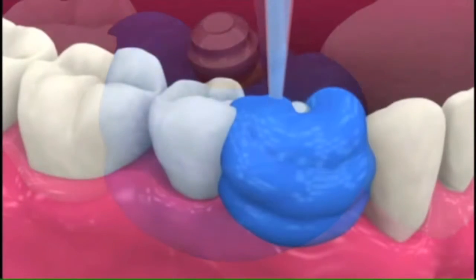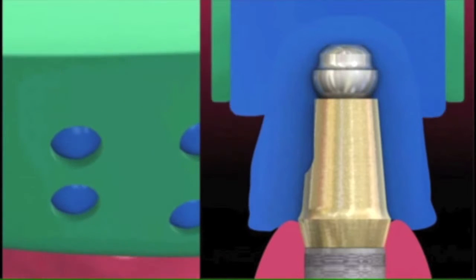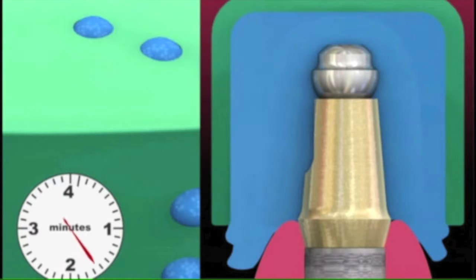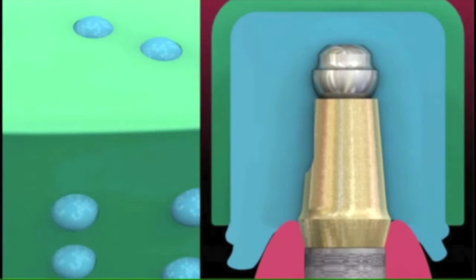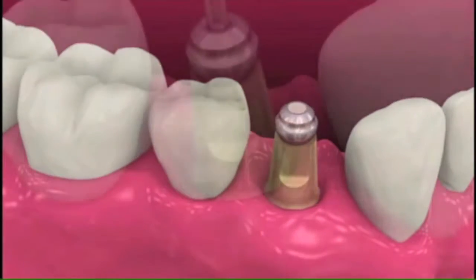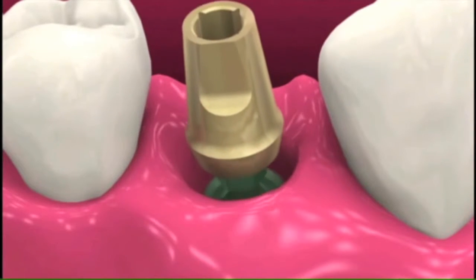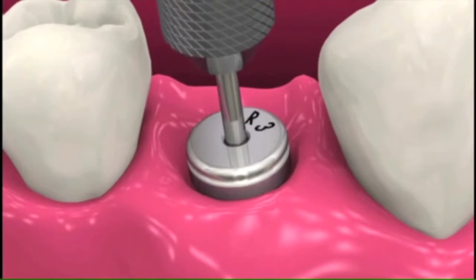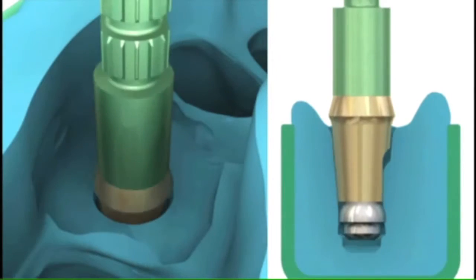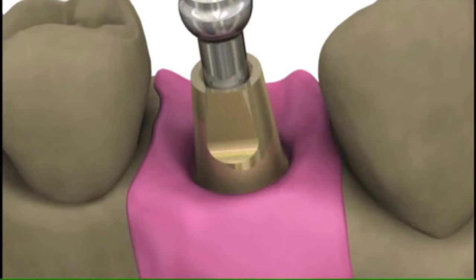Simple crown and bridge technique. Place this closed tray over top. You wait your time. I think they're waiting 4 minutes for their material to set up. Once it's all done, remove it. It now has an impression of that coping. Remove it, attach it to your implant analog, which is basically a copy of the platform of the implant. There's the analog right there. And it looks just kind of like a lab portion of a copy of your implant. And there you have your impression.